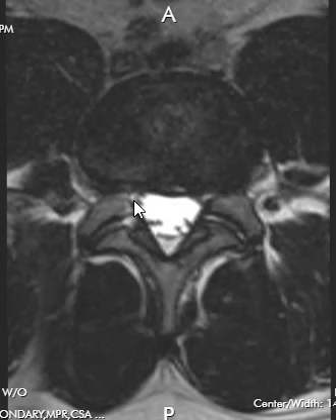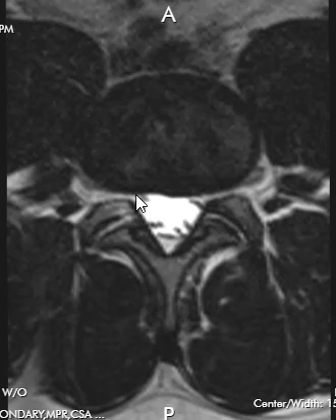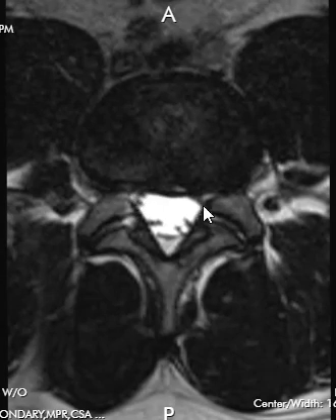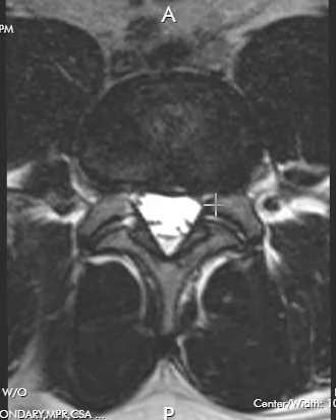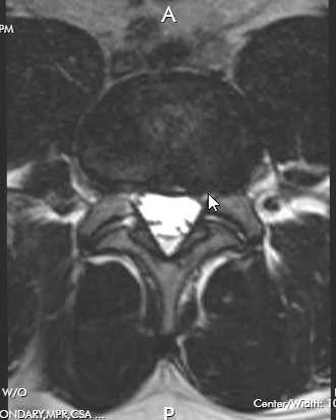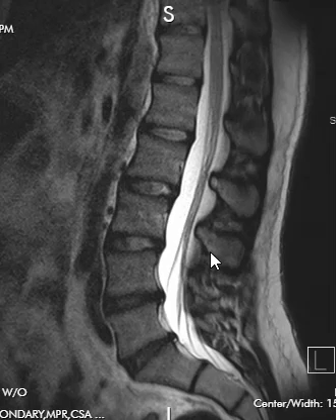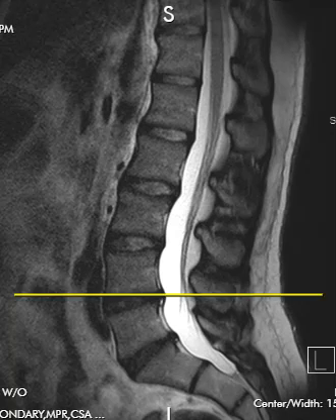Coming down, the nerves have exited fine. Here's the central canal, and to the right is called the lateral recess — a little area where the nerve goes out and gets ready to exit at the level below. On the right lateral recess you can see the fluid has a little opening and the nerve sits there comfortably. On the left-hand side, however, the left lateral recess is narrow. There's a central disc protrusion extending into the left pre-foraminal space, causing narrowing and pinching of this nerve — there's no gap for the nerve to fit. This is left lateral recess stenosis, pushing on the left L5 nerve root. So we assess the central canal, the neural foramina, and the lateral recesses, which are best seen on axial images.